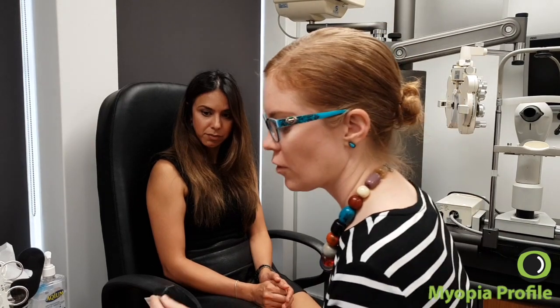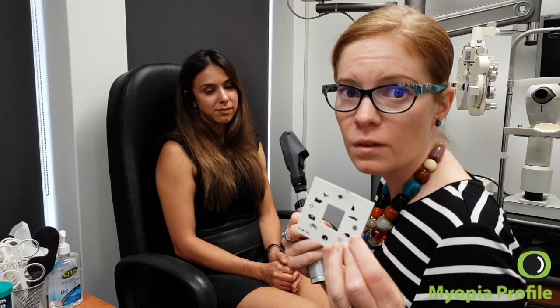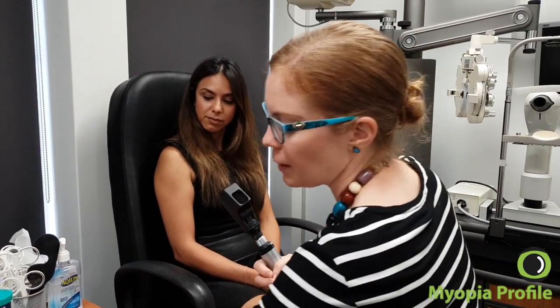I also need to mention the target. You can get near cards to stick on your RET for children or adults to look at, or for younger children you can get targets with images. This makes sure that we have an accommodative lock — a proper target — and you tend to get lower results that way because the patient's actually got something to look at. It more closely simulates what happens in real life with reading.